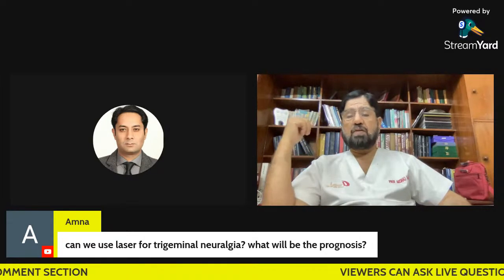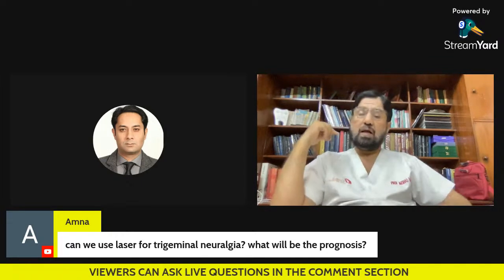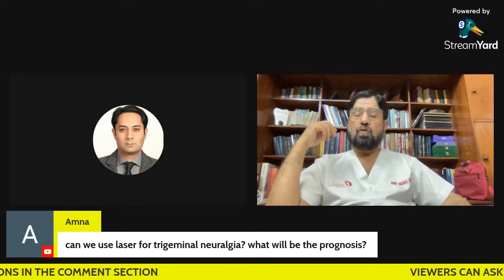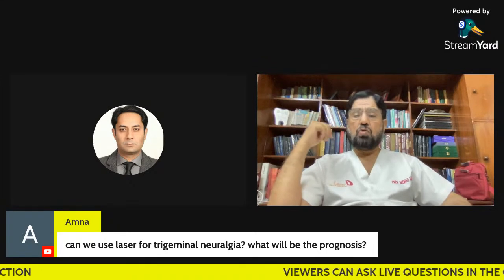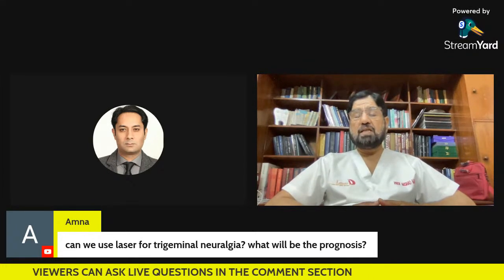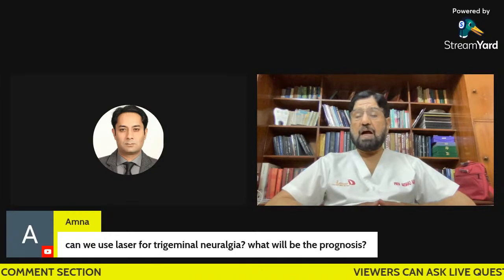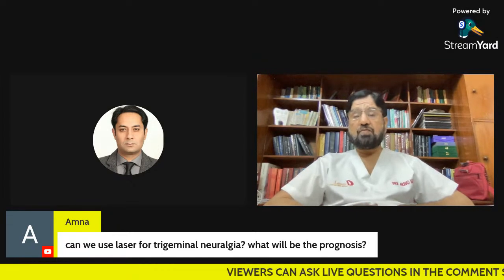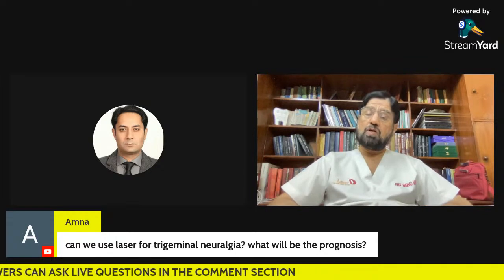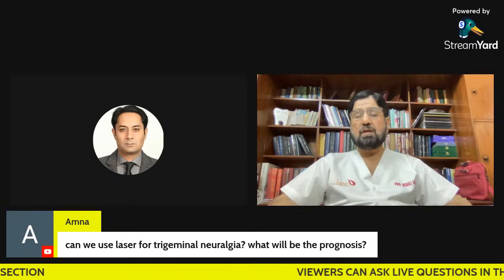Secondly, there is photobioactivation. It has been shown that on the trigger points, we apply certain joules, say 4 to 5 joules of energy of the soft laser, to these areas intermittently for 2 to 3 days. It results in a better healing pattern of the myelin sheath, and that results in a reduction of the episodes of trigeminal neuralgia in that patient. No doubt it has an effect on trigeminal neuralgia management, both with the soft laser as well as the hard laser.